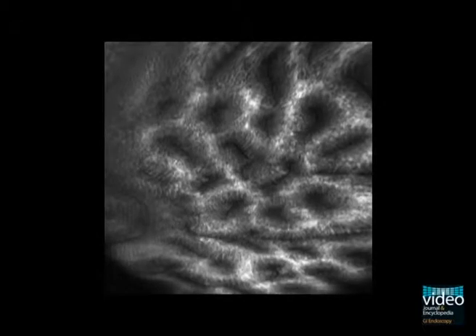We will now move on to normal Barrett's epithelium. The most important feature that distinguishes Barrett's epithelium from other mucosa is the presence of goblet cells. The mucin in the goblet cells gives the cells a dark central spot in the epithelium. Also note the appearance of cylindrical, regular cells and the presence of a brush border.